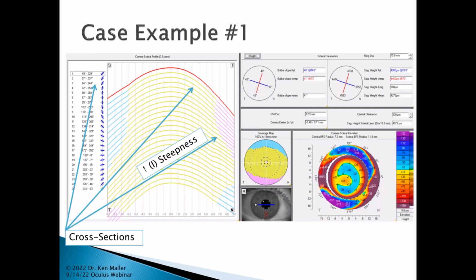First thing you can see is that in that inferior portion where the pink arcs are, we have an increased steepness, because look at how the pink arcs are diving down toward the bottom of the screen at a very sharp angle. We can further take a look. Right there on the nasal portion, we have an elevation because you see the deviation that's happening to those golden yellow, or golden green, arcs over there. But you can see that there's a displacement up, and that's actually something that's elevated on the nasal side.